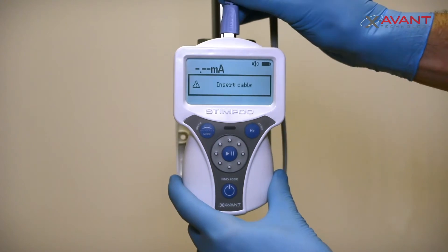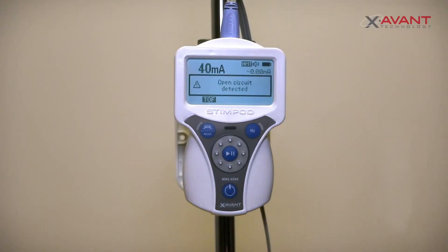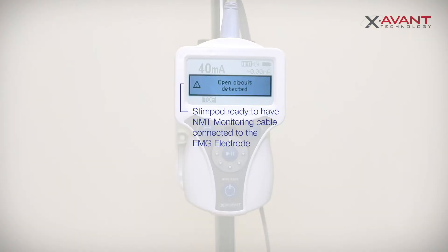Connect the NMT monitoring cable EMG to the StimPod. An 'open circuit detected' screen prompt will appear. The StimPod is now ready to have the monitoring cable connected to the EMG electrode.